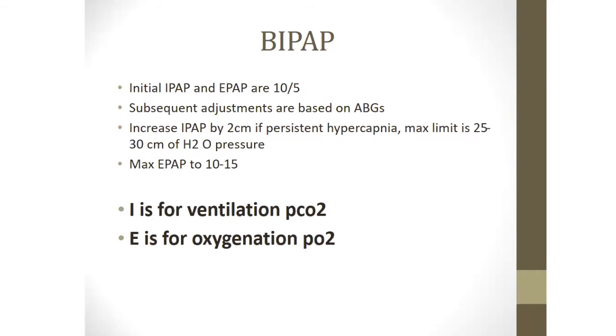Always remember, I is for ventilation, that is for PCO2, and E is for oxygenation, for PO2.